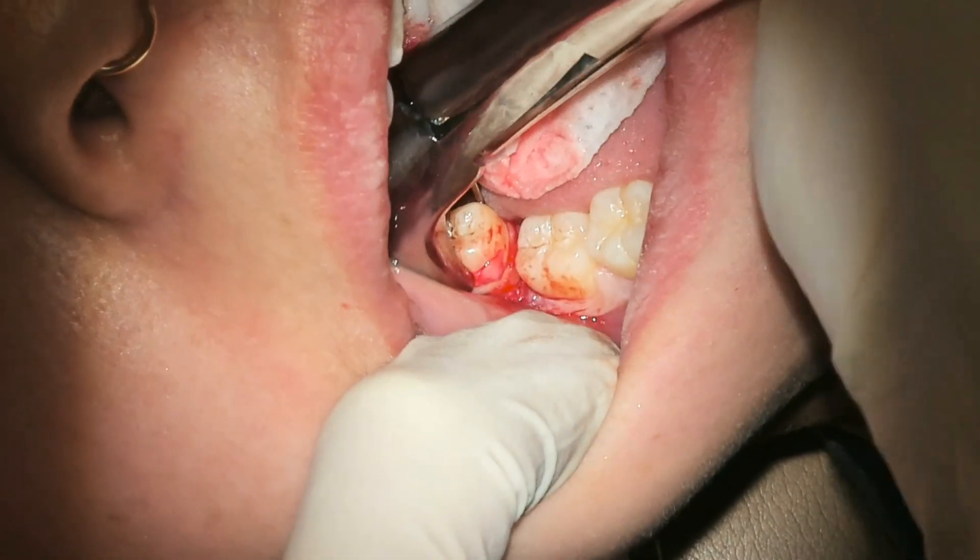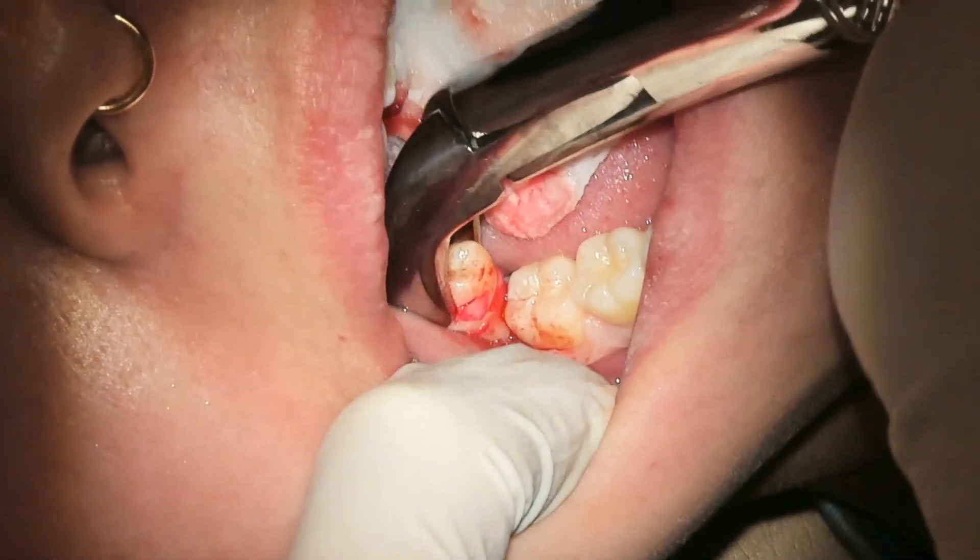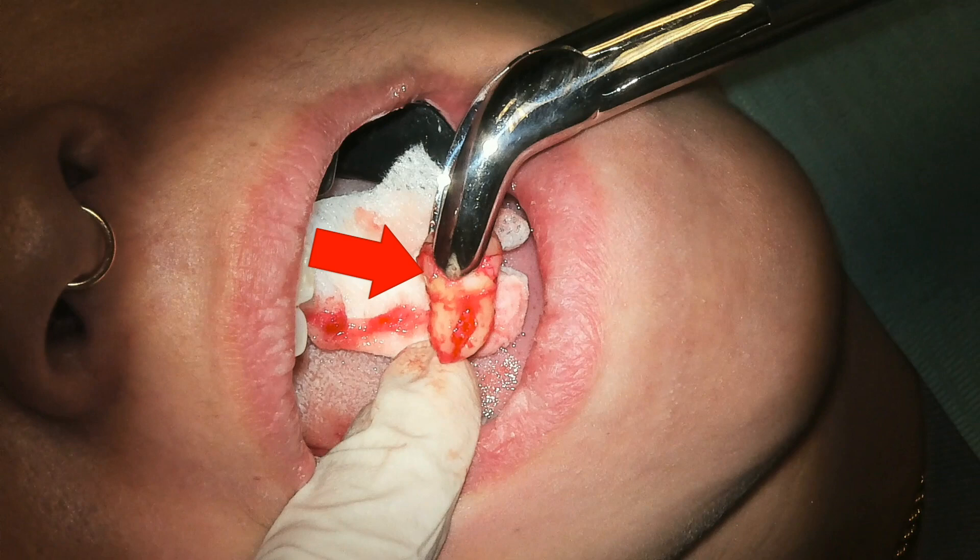The tooth is out. We went ahead and attempted to do figure-eight and conical motions. I'd like to pause and show you where the forceps ended up after the extraction. I'd like you to take a couple of seconds after your next extraction and see where the forceps are located. If they're located very high, like here in the red, then you could ask yourself: did I have the forceps all the way down to where I needed to have them? Here the bone was in the way, so I couldn't move that forcep more apical. In the best case scenario, I can get the forceps closer to the CEJ. But here, due to the bone displacing our forcep, I'm not able to get it any deeper, which increases the risk of fracture, of course.